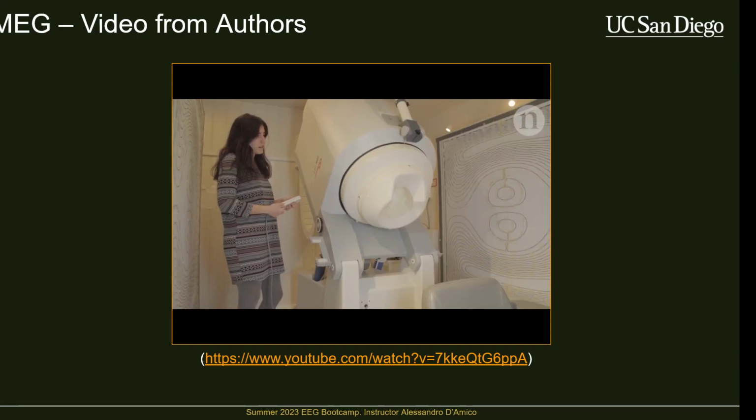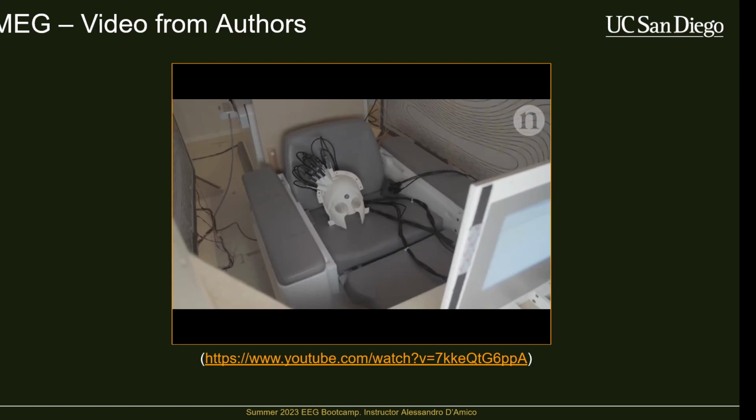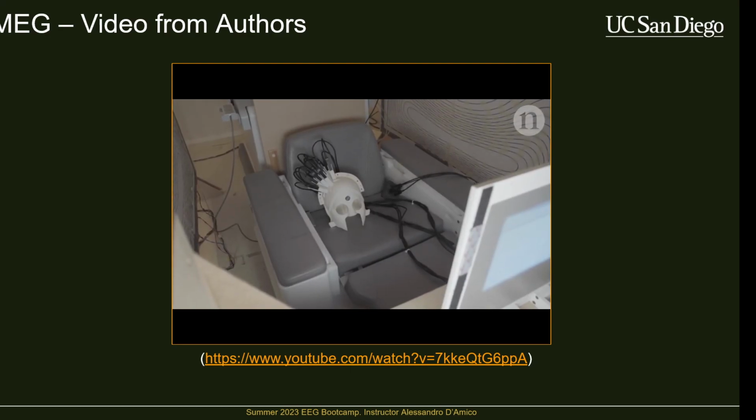The problem with current MEG scanners is that they're very large, they're very bulky, and they're one size fits all. The gap in the market, if that's the right expression, is for a scanner which you can wear on your head. So you put it on like a helmet, you can wear it on your head whilst we're acquiring the data.